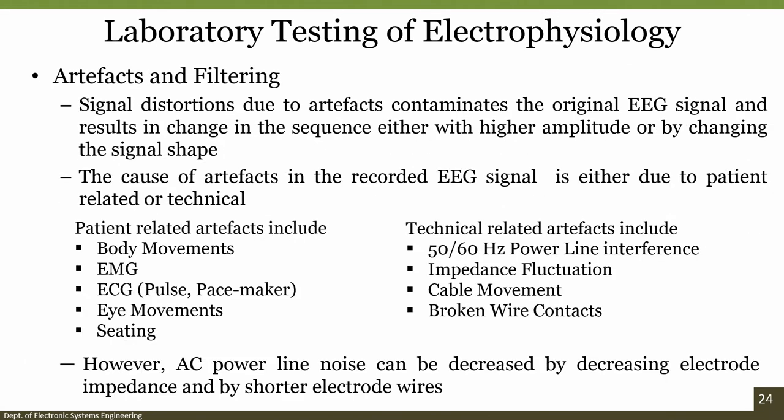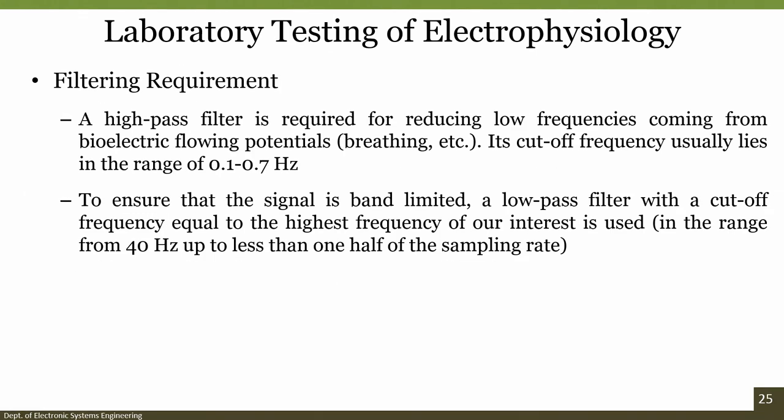Further, this is about artifact filtering. So what are the filtering requirements? We require a high pass filter for reducing low frequencies coming from bioelectric flow potentials.